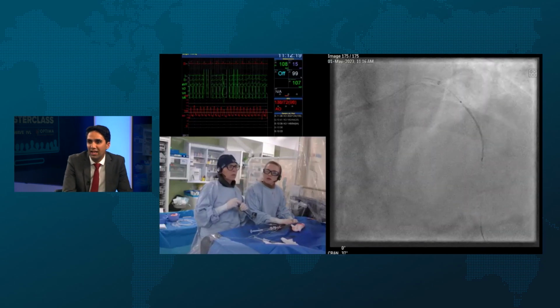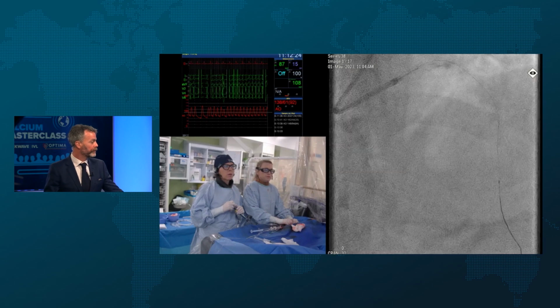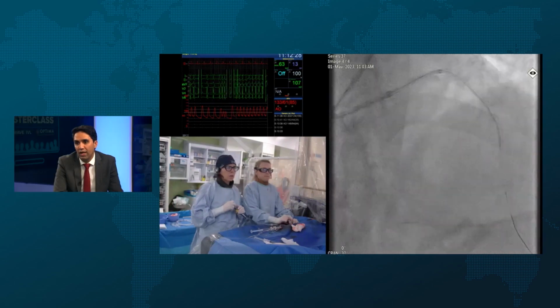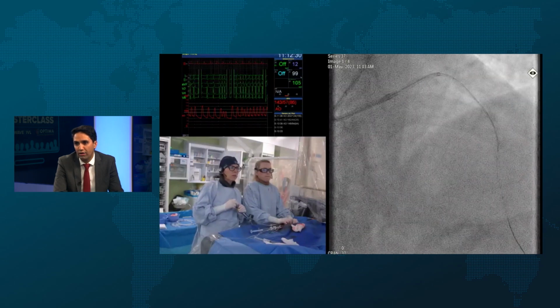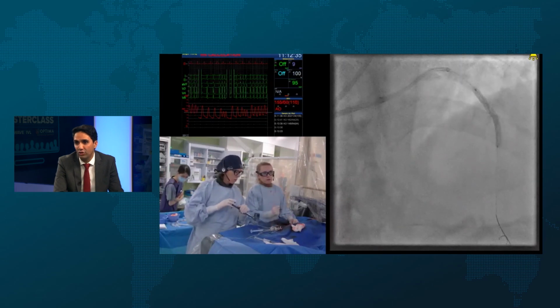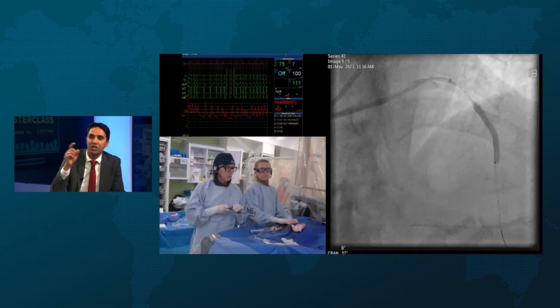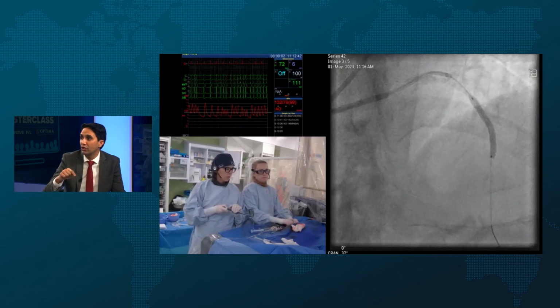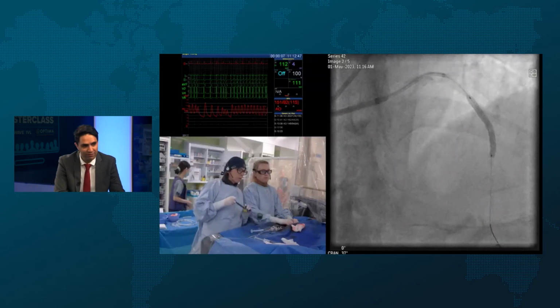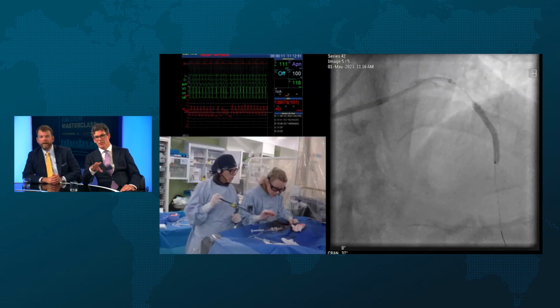That was my question. Are they more common in certain parts of the artery? We don't know. Akiko and our group are working on an important study where we have seen in 12 patients that when you stent the eruptive nodule, you change the torsion in the artery to the next focal point just distal, so the next nodule happens just distal to the stent edge. It's like you're just pushing it along.